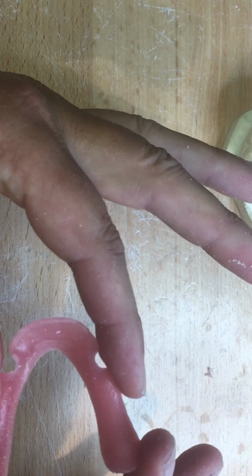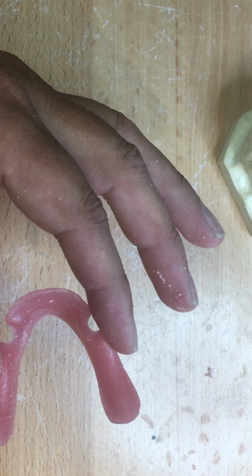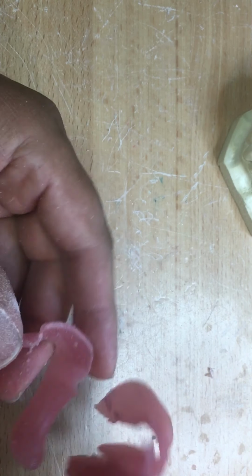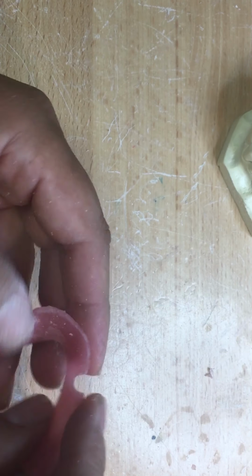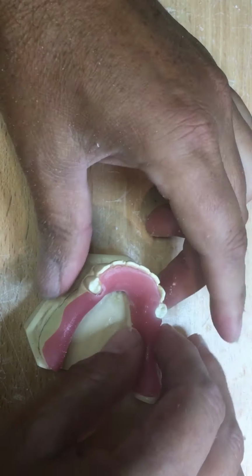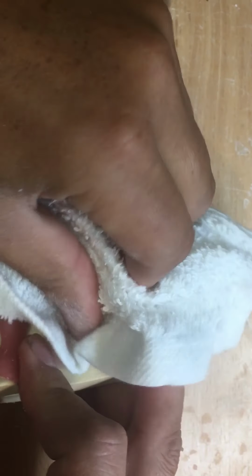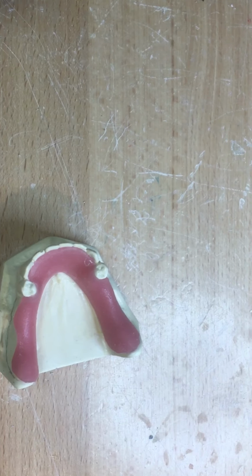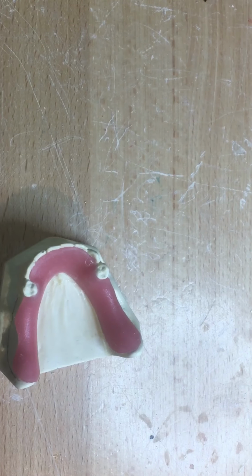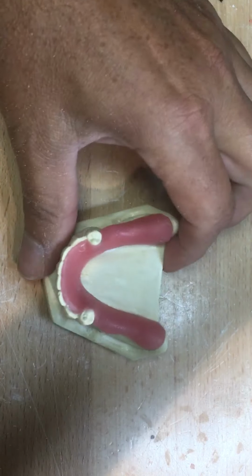If you feel that you've pushed too much and you've got a lot of flex in yours, you can always go back and add some more if you wish. Or you could have done 2 to begin with at the start. I mean, I've seen very many creative things here with dental technicians putting in paper clips, etc. Or if you think the dentist you're working with has the hand of a giant with a touch of 200 pounds per square inch, then maybe you need to stiffen it up a little bit more.